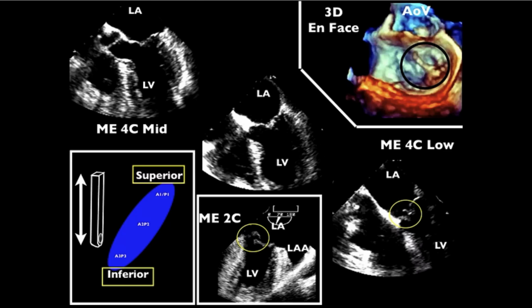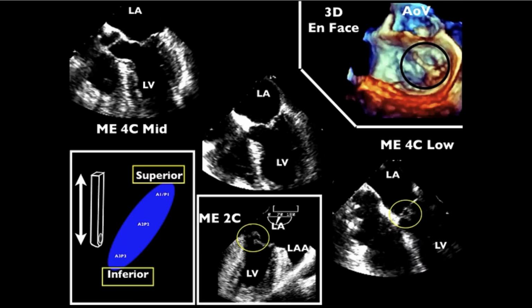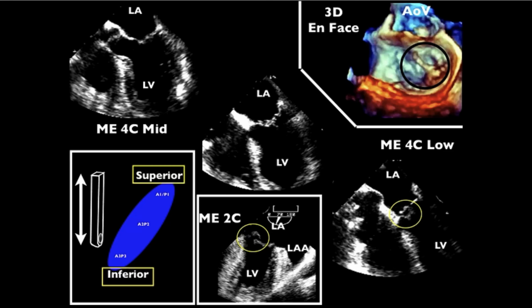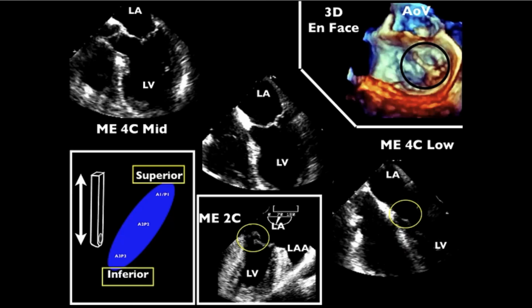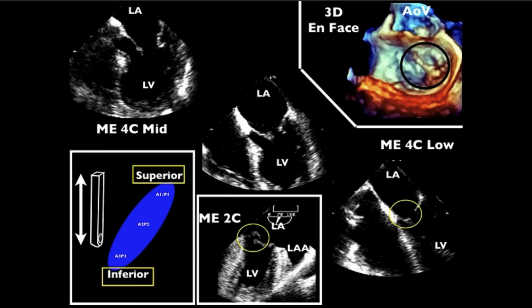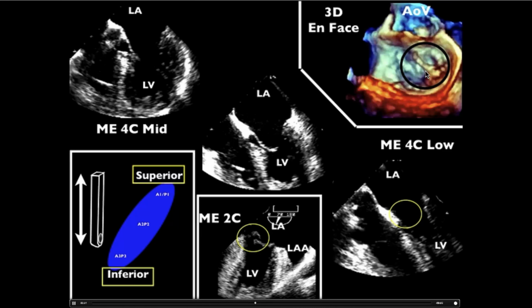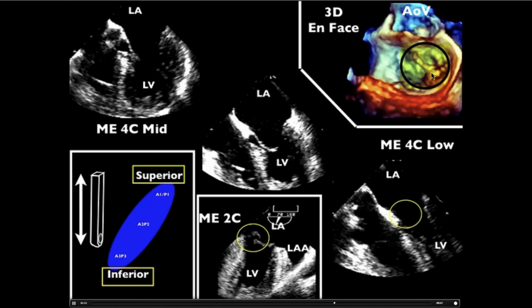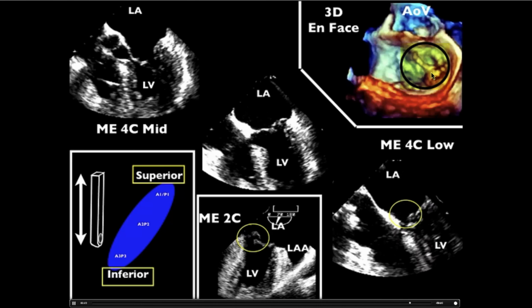And as you advance the probe just a little bit into the middle video and then to the bottom right, suddenly as you get well below the outflow tract, you can see an excessively mobile leaflet, and that actually is P3 when shown in our bicommissural view just next to that. But more importantly, you can see the flail portion of P3 right here. So depending on how you advance and or withdraw the probe or rotate the probe, you'll get different scallops during your two-dimensional imaging.